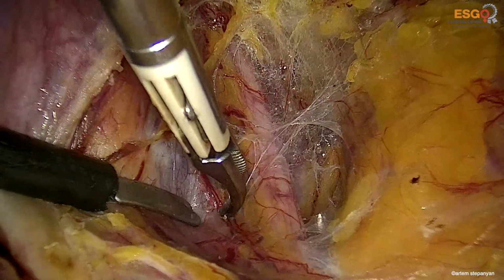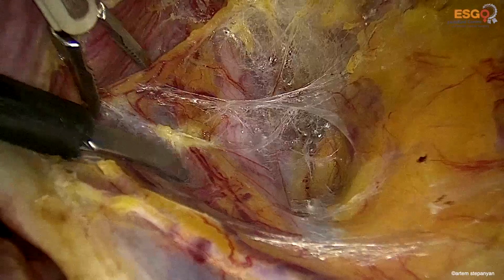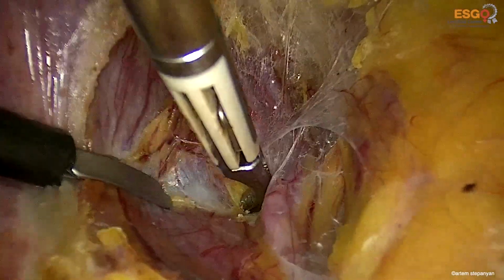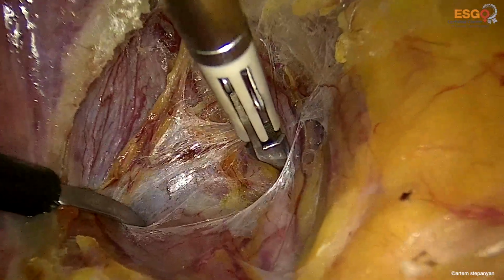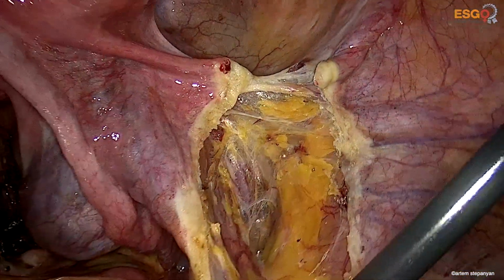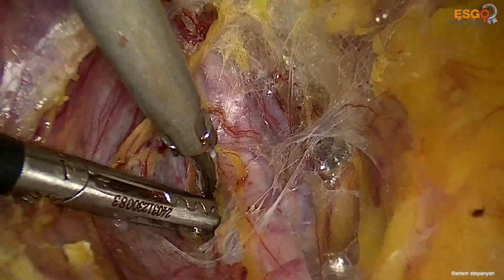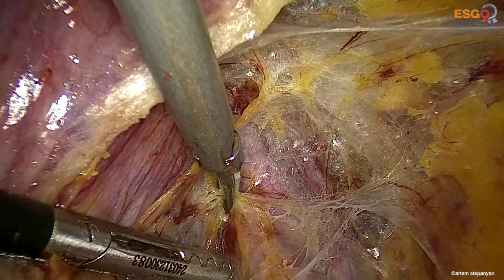And then we're starting the entering into the Okabayashi space. It can be done sharply or bluntly, or in combination of sharp and blunt dissection as we do in this video.